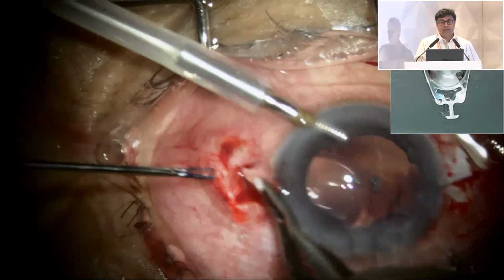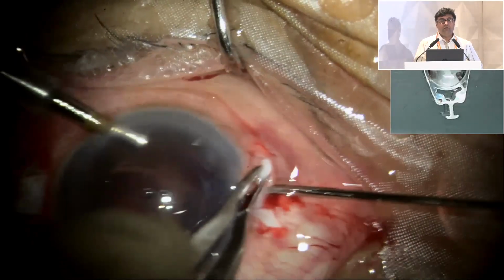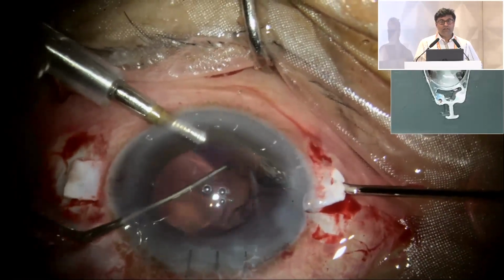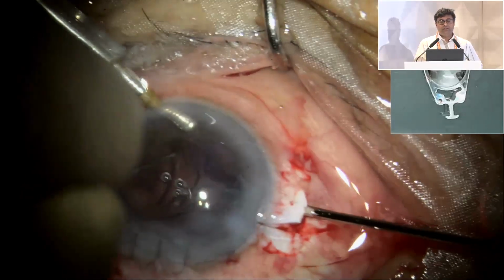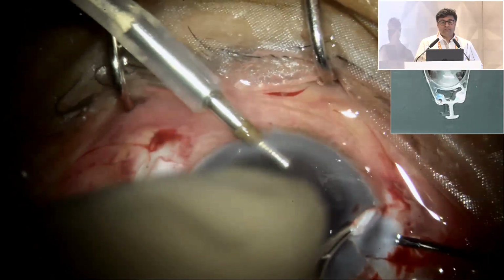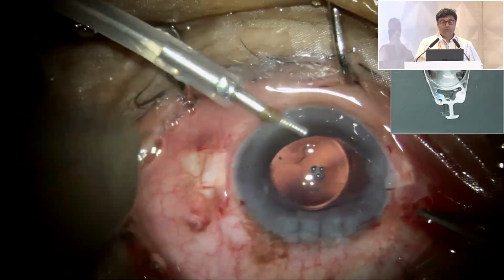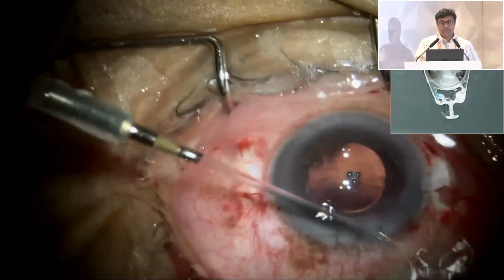These are hydrophilic haptics and they stay very well outside the sclera under the flap without any risk of extrusion or irritation because they are essentially hydrophilic in material as against prolene, which we usually use in scleral fixated lenses. So here the hydrophilic material, again the other haptic being brought out through a slit incision which is done exactly perpendicular to the orientation of the haptic, and there you put the haptic under the flap, and that's about it, and you get the surgery done very quickly.